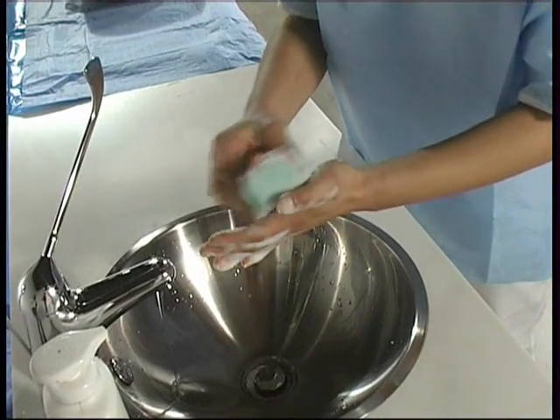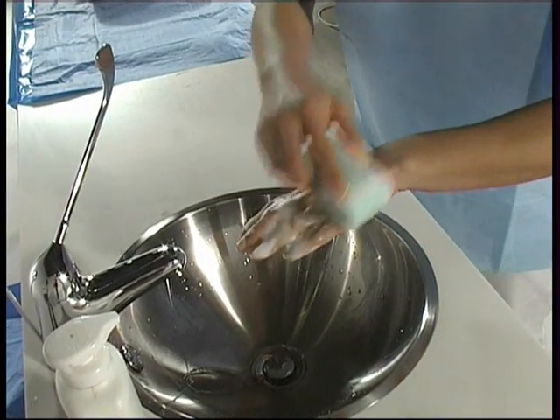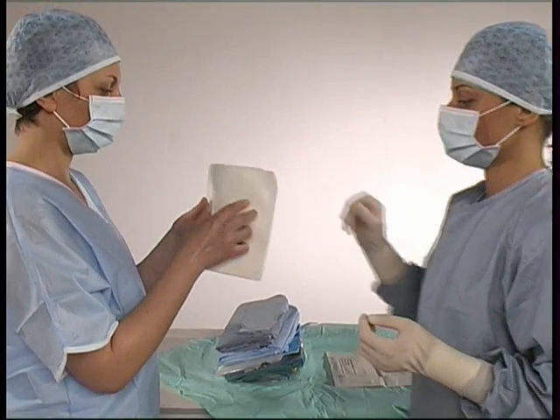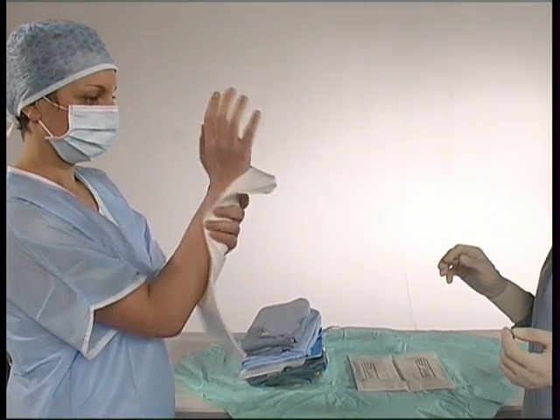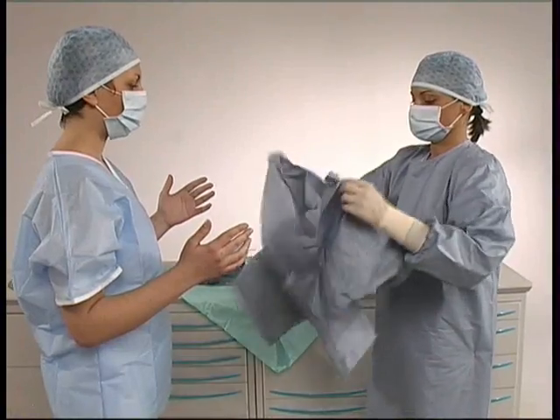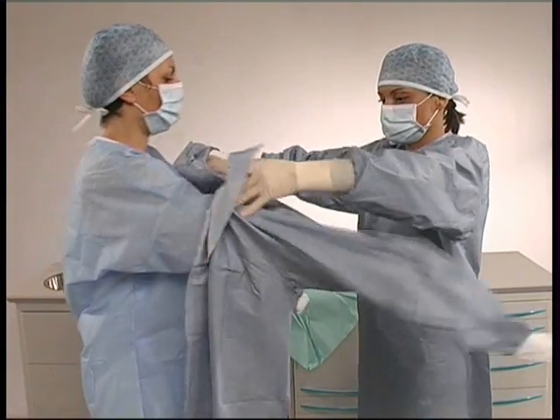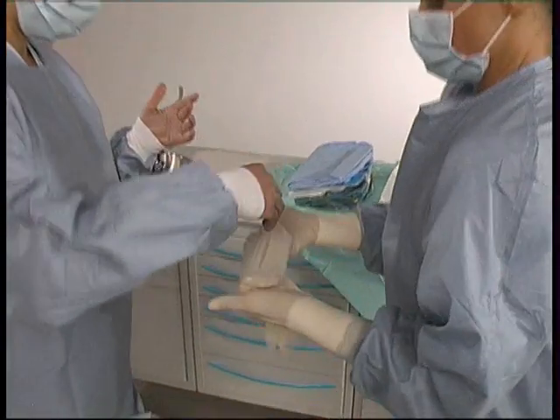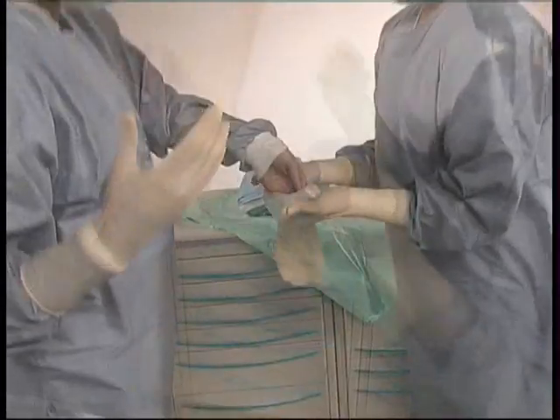The second assistant and the doctor proceed to wash their hands and dress. Having completed the hand washing and drying procedure, the preparation is completed with the assisted dressing of both assistant and doctor. In this case, the sterile assistant fully unwraps the gown, allowing the other operator to put his hands in the gown arms and out at the cuffs. The already sterile assistant also helps with putting on the gloves and closing the gown.